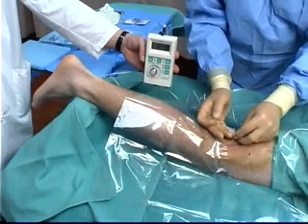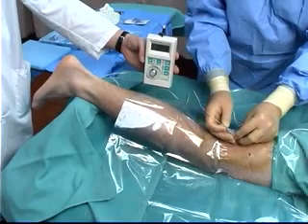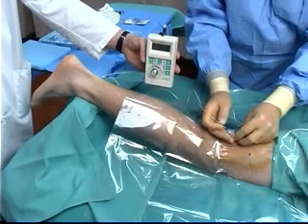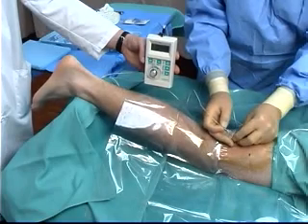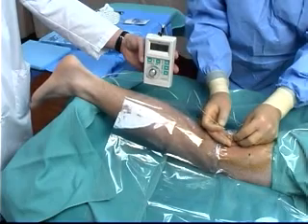The stylet of the needle is removed. The nerve stimulator is attached to the proximal end of the catheter, and the distal end of the catheter is placed inside the needle shaft. Hold the proximal end of the catheter in the palm of the left hand. The broad black mark on the catheter indicates that the catheter tip is at the tip of the needle.